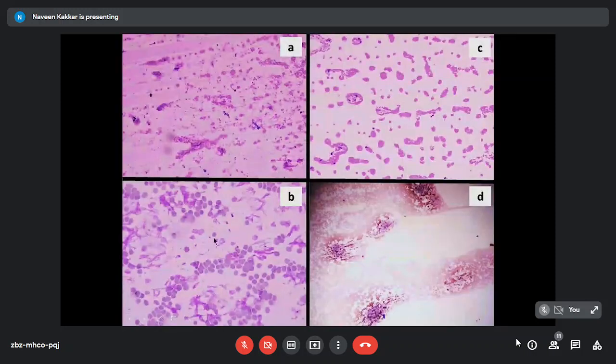So what was the problem? These samples had fibrin clumps. If you see this in the tail, there are wisps of these, colorless wisps. These are fibrin strands. You can see them better here, individual strands. Once they are aspirated in the channel or through the aperture, they will be misread as WBCs.